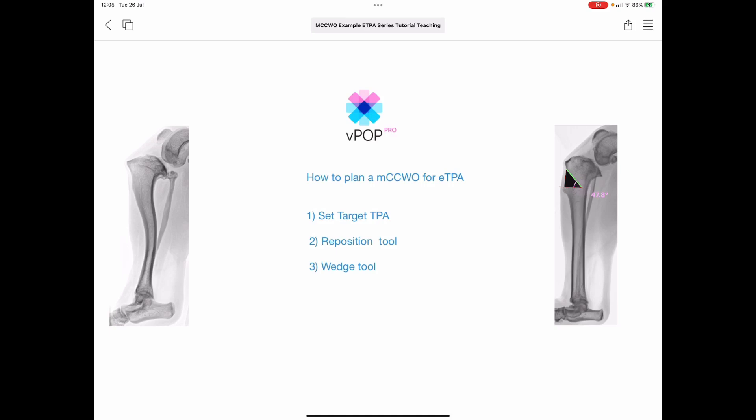Welcome to another VPROP Pro tutorial, everyone. This is the first in a series of eTPA leveling videos. Today we're going to go through two precise planning options for getting a five-degree post-op TPA every time with a modified cranial closing wedge osteotomy technique. We'll show you how to set your target TPA — in this case five degrees — then use the reposition tool and the wedge tool to take a reproducible, intuitive plan into the OR.